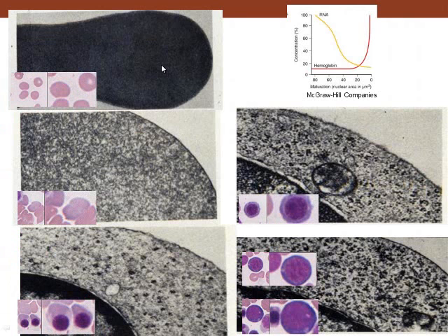And so if we start with what we know, red blood cells, that's got hemoglobin in it, and this is what we see. And then the reticulocytes have some ribosomes in there as well. And here we see the ortho. They have some ribosomes in there as well, still persisting. And then if you get the polychromatic, you get different colors because you've got a host of ribosomes and a host of hemoglobin. So you've got both red and blue in there.